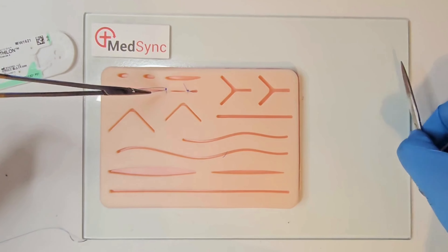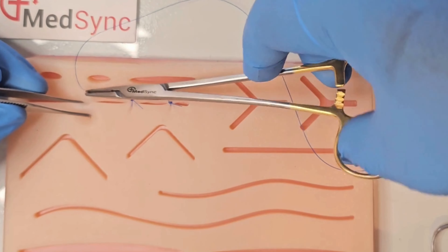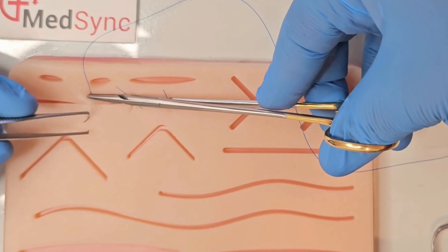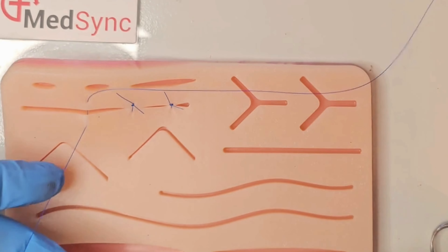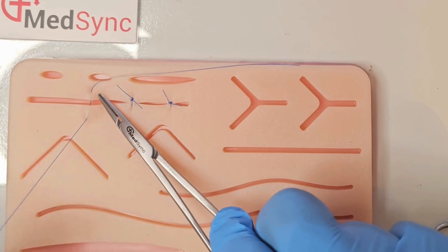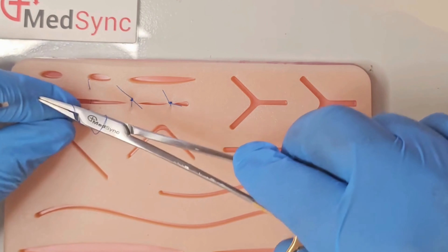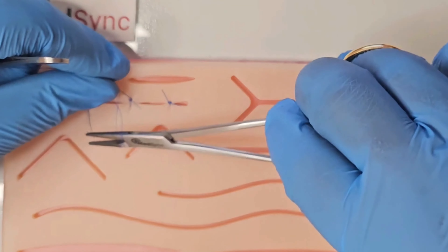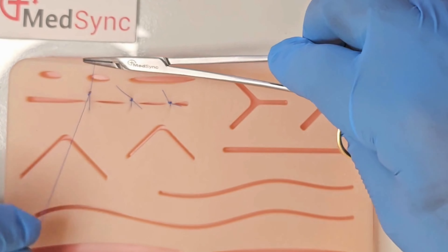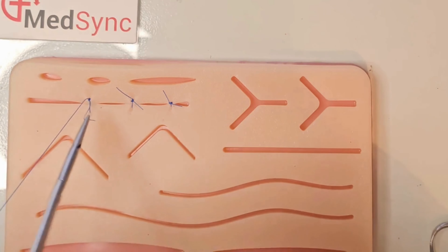Repeat this manoeuvre twice more with a single revolution around the needle holder each time. The end point is the approximation of dermis to dermis, epidermis to epidermis. Enter at 90 degrees, pull the suture through. Lay the needle holder between the long and short ends of suture and perform two revolutions — this is a surgeon's knot. This is followed by a reef knot, which is a single revolution around the needle holder. The suture ends must alternate in position each time.